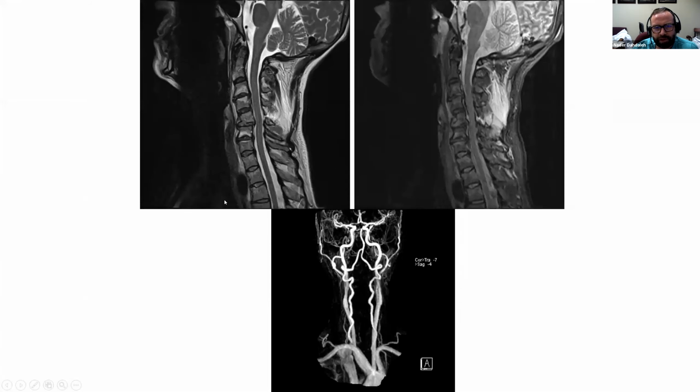Definitely, when you get that MR, you also see the posterior tension band. So this fracture obviously qualifies as an unstable fracture. It's a teardrop fracture, unstable fracture. And she got a CTA or an MRA that didn't show a dissection. So how would you treat those usually?